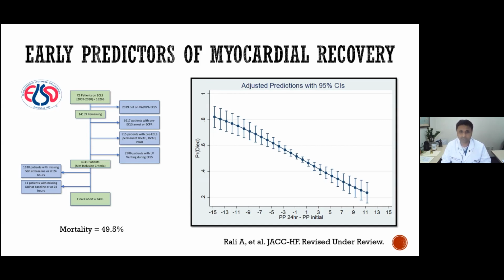This is another question that we are in the process of analyzing using the same registry, to see if LV venting benefits those that do not have early predictors of myocardial recovery. Again, this is a retrospective analysis of a large database, so take it with a grain of salt.